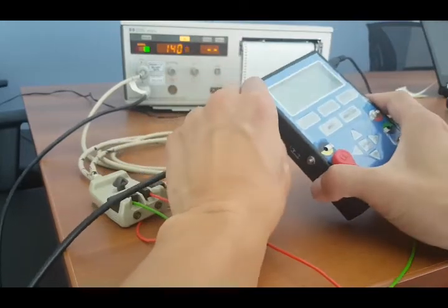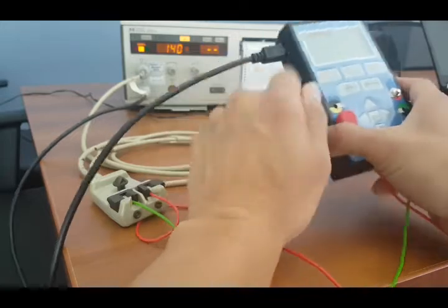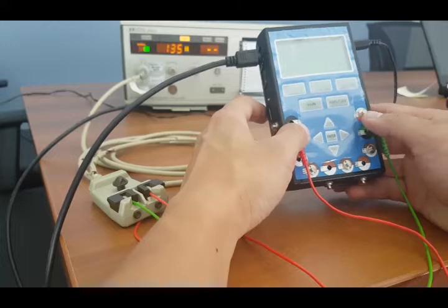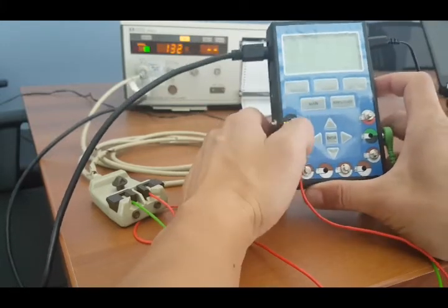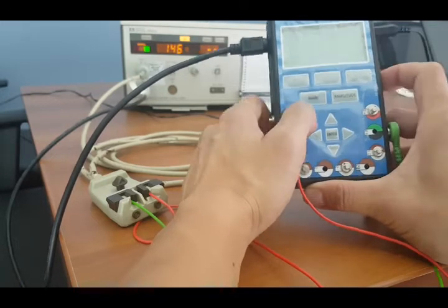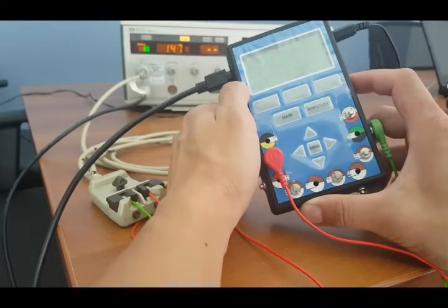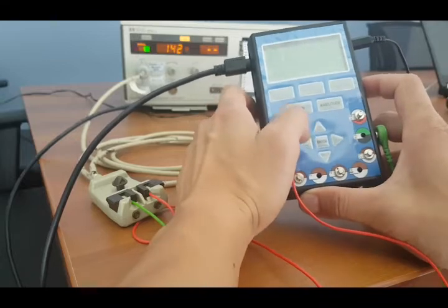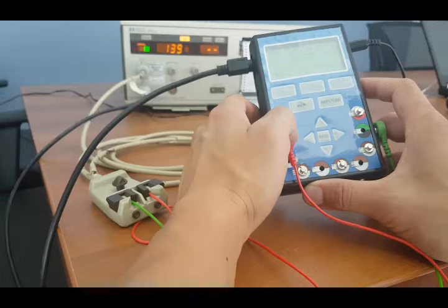Finally, for US3, there is no option or screen to configure this particular output. We consider that most likely you will not need to test this particular scenario, but at the same time, it does approximately generate 140 beats per minute. So if you want, you could set the signal differently for US1 versus US2 and US3, and you should be able to detect 3 different signals from 3 different ports at the same time.